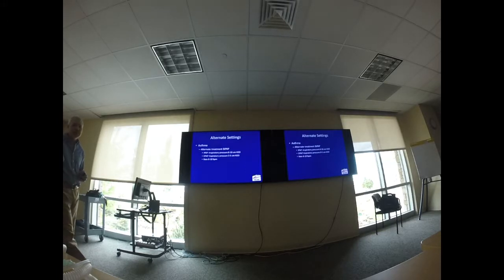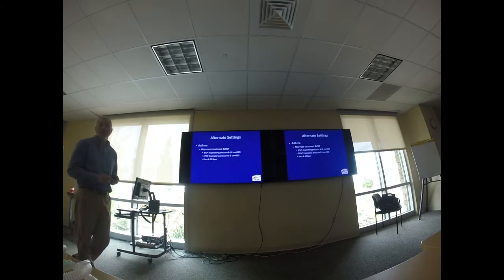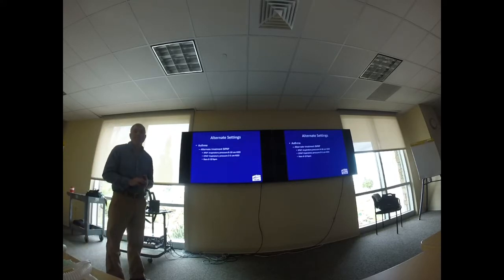Jace, did you have a question? Yes, so for when we're setting this up on the vent and the IPAP is 8 to 10, are we talking about that being the pressure support or the initial, because isn't it additive? It is additive. So is the IPAP 8 to 10 in the pressure support way, or like when we're initially setting it up? I'm going to show you how to set it up so that it's less complicated for you. Does that work? So can we just save that until we do lab? Yeah, that's fine.